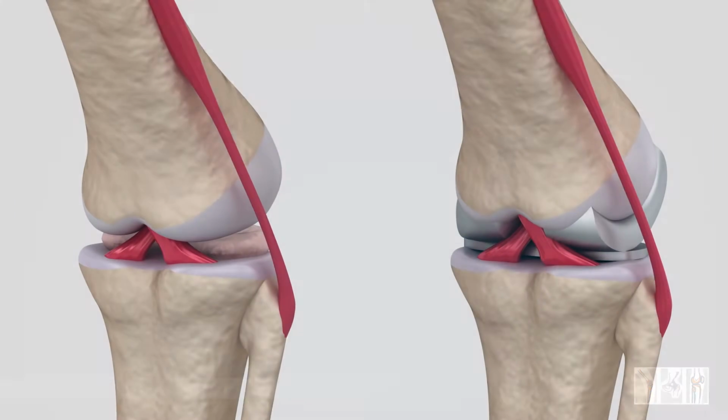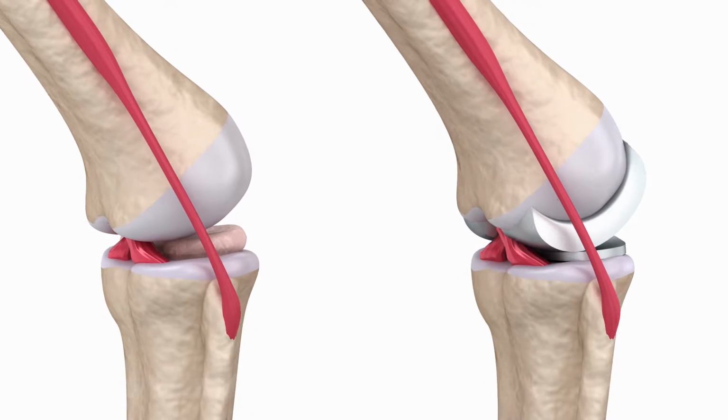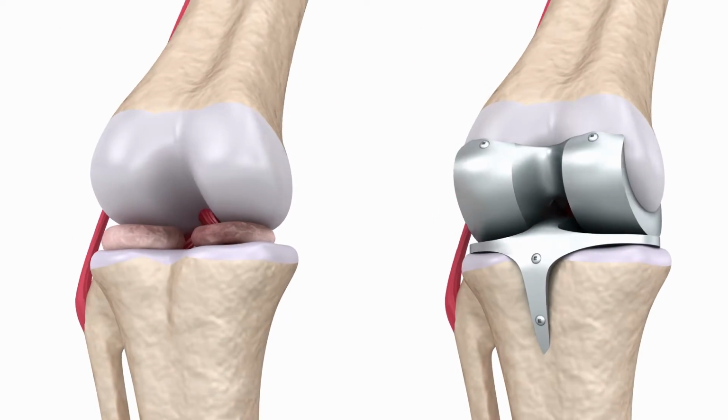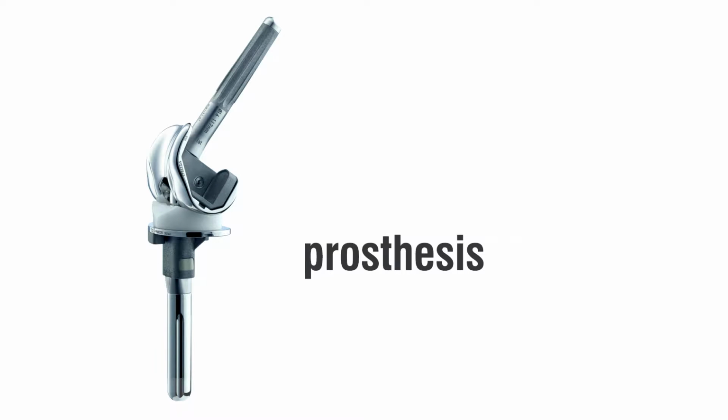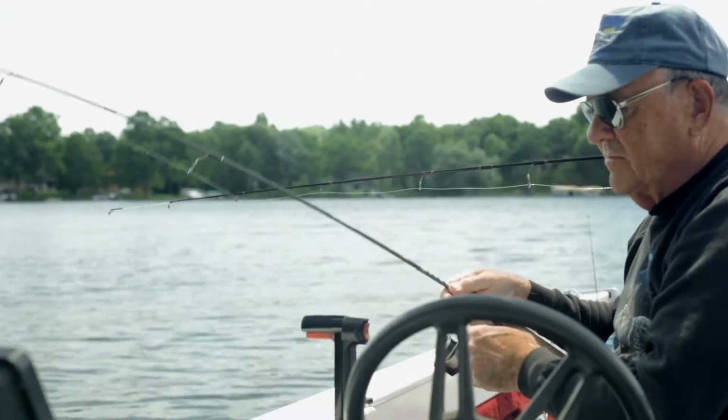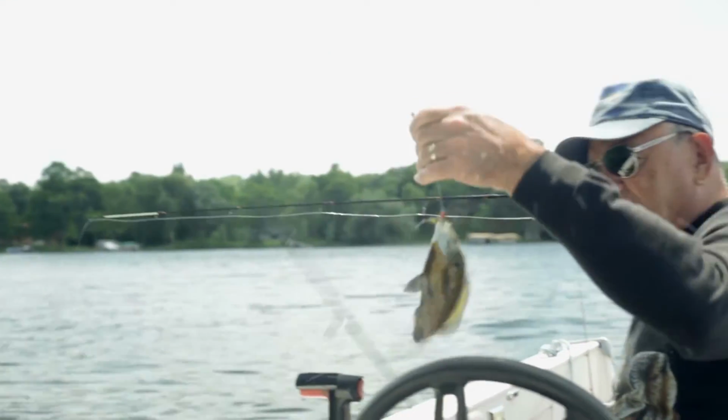So, what is a knee replacement? A knee replacement is a common type of surgery where the damaged knee is replaced with an artificial joint, known as a prosthesis. A prosthesis is an artificial body part which replaces a damaged or missing part of your body. New materials and technology will in most cases allow you to have a normal and active life.